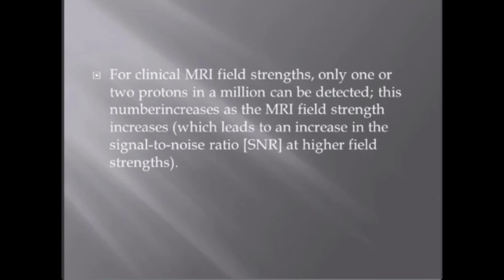For clinical magnetic resonance imaging field strengths, only one or two protons in a million can be detected. This number increases as the MRI field strength increases, which leads to an increase in the signal to noise ratio at higher field strength.